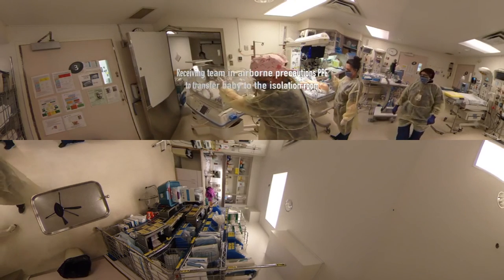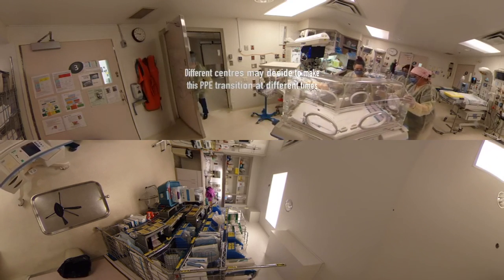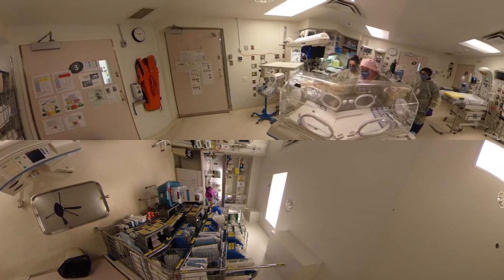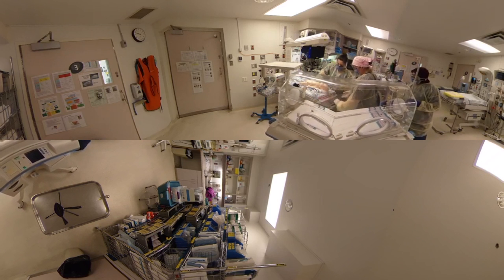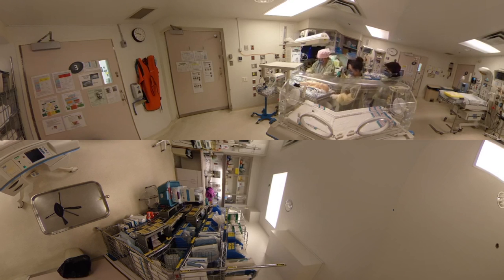We've got the isolette ready to go here. Open the doors. Let's just make sure we have all our wires. Are we ready for transfer? Yep. Secure the tube. You've got the tube. I've got the baby. And the IV. Ready?